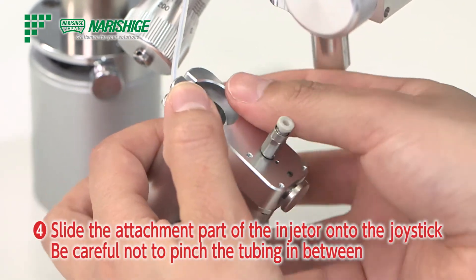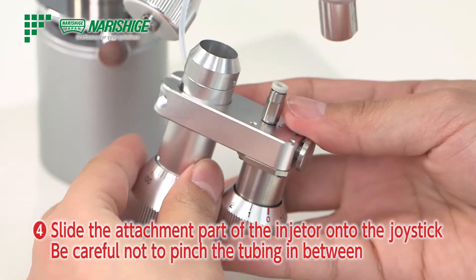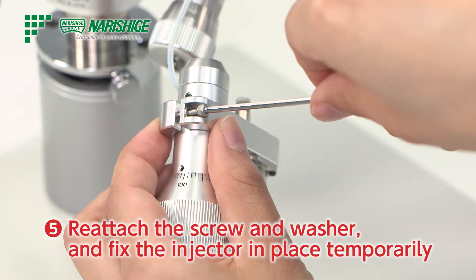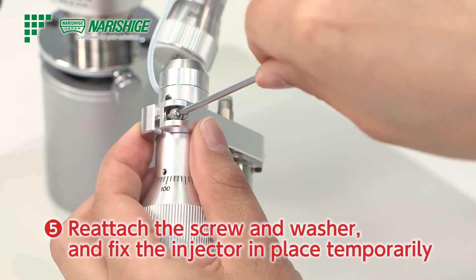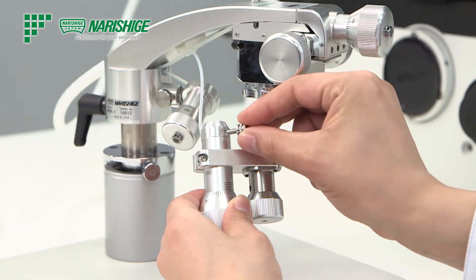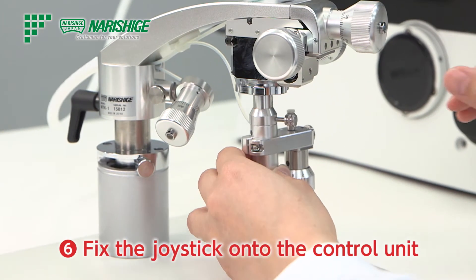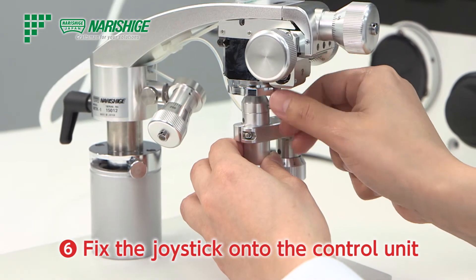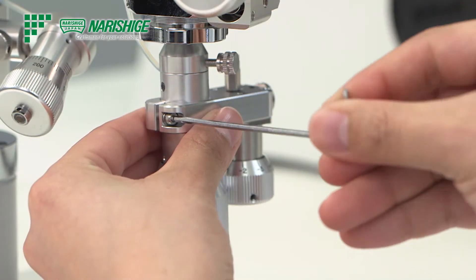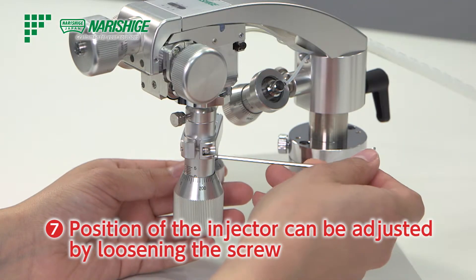Next, slide the attachment part of the injector onto the joystick. Be careful not to pinch the tubing in between. Reattach the screw and washer and fix the injector in place temporarily. Fix the joystick onto the control unit with the knob. Adjust the height and tighten the screw. Loosen the screw to adjust the position of the injector at the desired angle, then tighten the screw firmly.